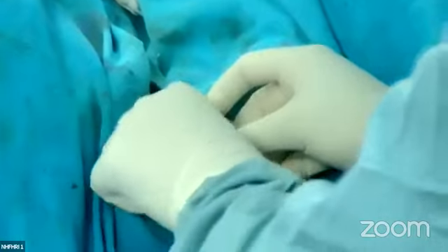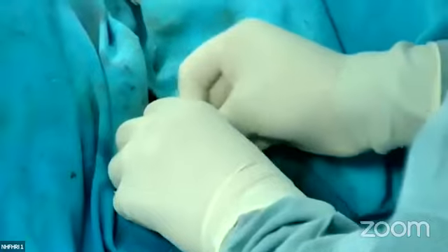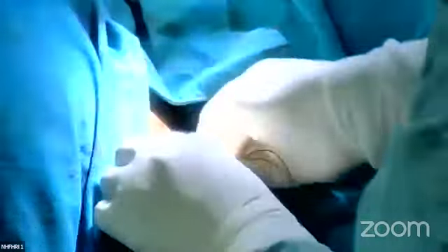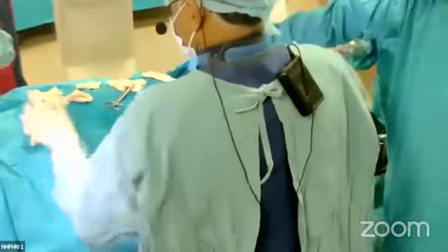Needle holder, thread please. The position of the lead in relation to the generator should be inside. It should be under the generator.